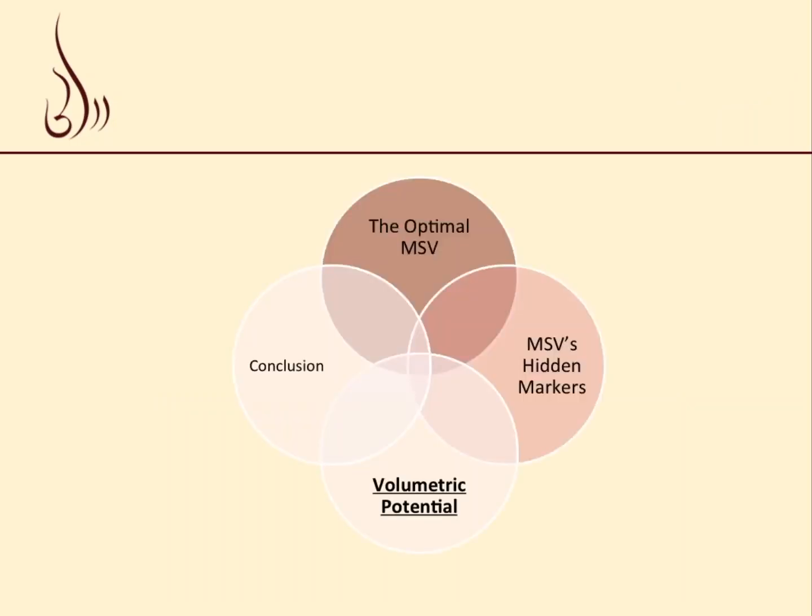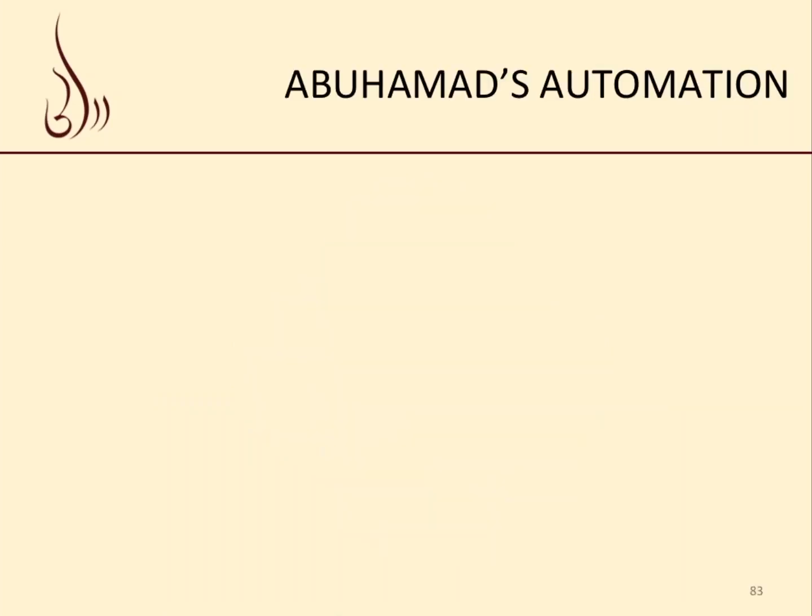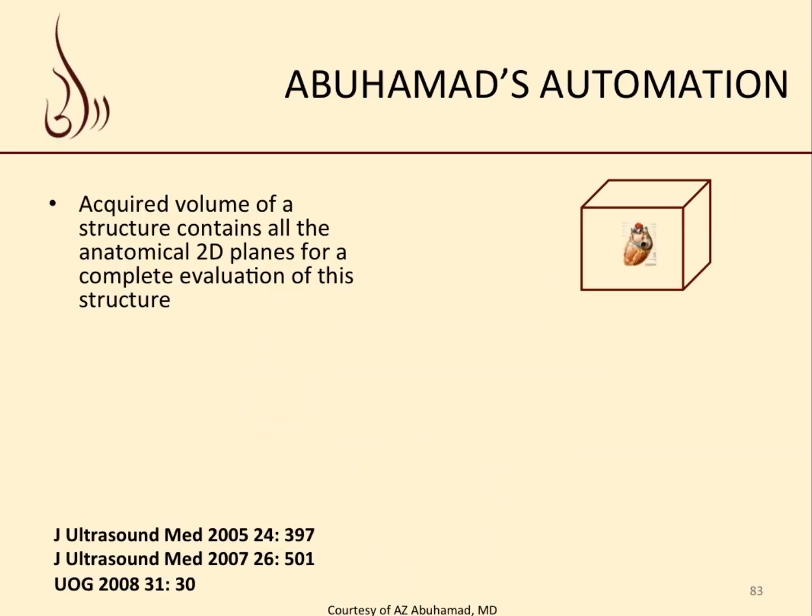Now we have covered all of the hidden markers of the mid-sagittal view, and I'm going to move on to volumetric potential. And I would like to start with the idea of the automated multiplanar imaging, which was introduced by Professor Abu Hamad back in 2005.